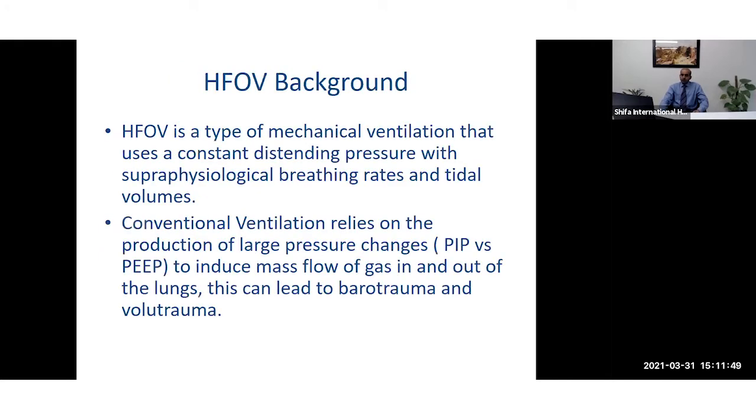So what is high frequency ventilation? It's a type of ventilation where we use a constant distending pressure, but the breathing rates are quite supraphysiological and the tidal volumes are quite low. Conventional ventilation relies on production of large pressure changes to induce flow of gas in and out of the lungs, and that can cause barotrauma and volutrauma.